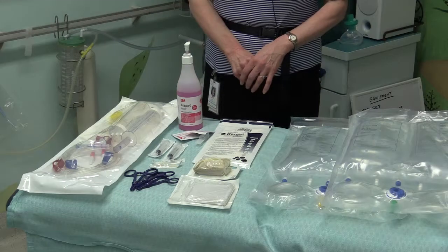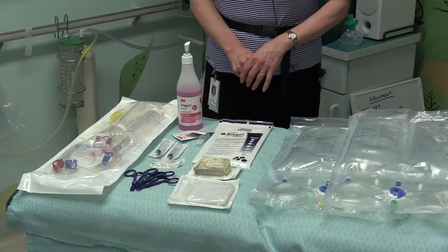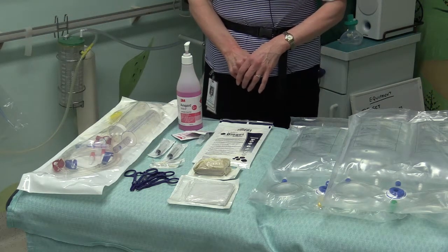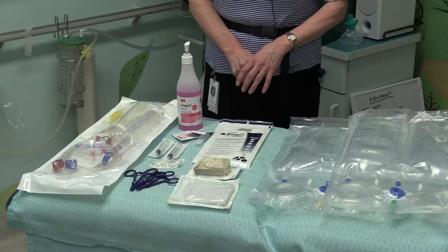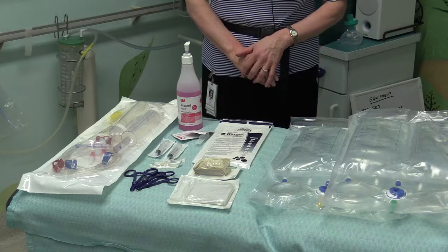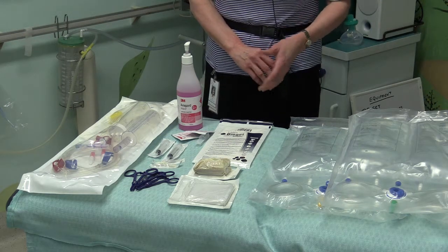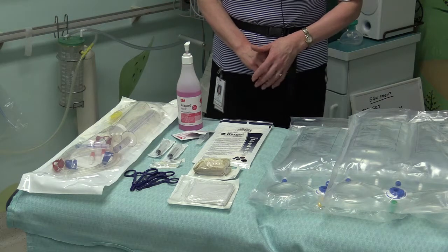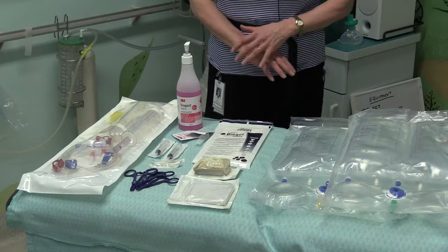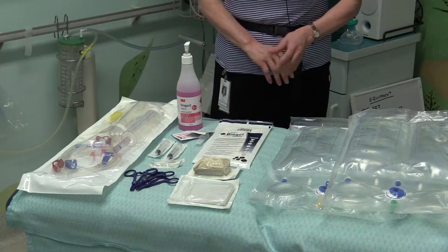I'm going to go through setting up the peritoneal dialysis set. It's very important that the setup is done in a very clean area that's not crowded and there is no dust around, because infection is a major complication of peritoneal dialysis, leading to sepsis and treatment failure. So the most important thing is to prevent infection and be very clean and follow an aseptic technique strictly when you're setting up the equipment.